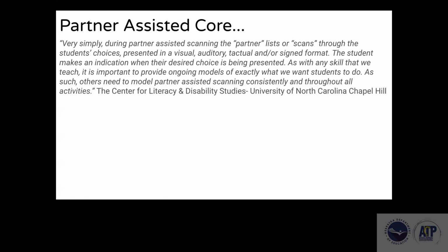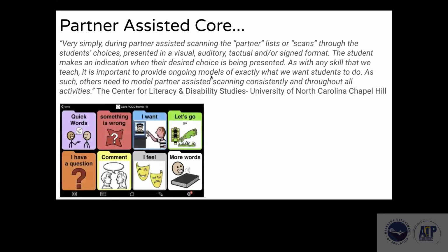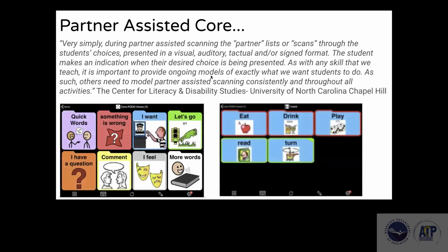As with any skill that we teach, it is important to provide ongoing models of exactly what we want students to do. As such, others need to model partner-assisted scanning consistently and throughout all activities. And that's what we do. And it's incredible how we have students successfully using it. So here's a couple examples, and I'll show you a video in a moment of us demonstrating how it works.